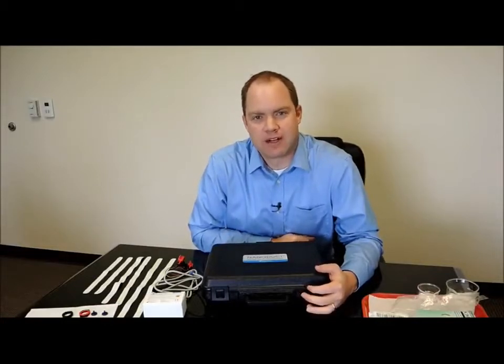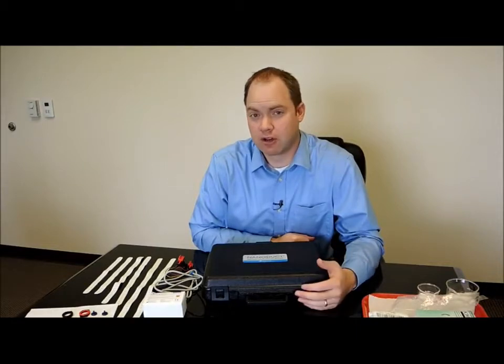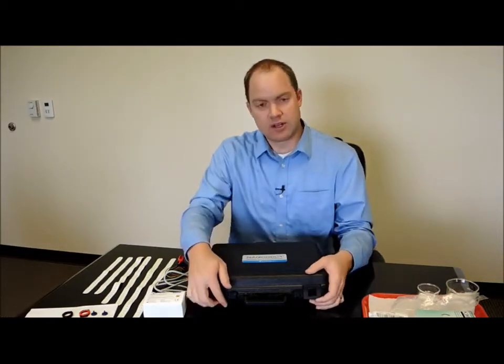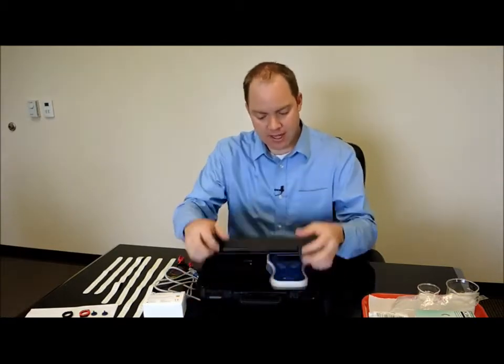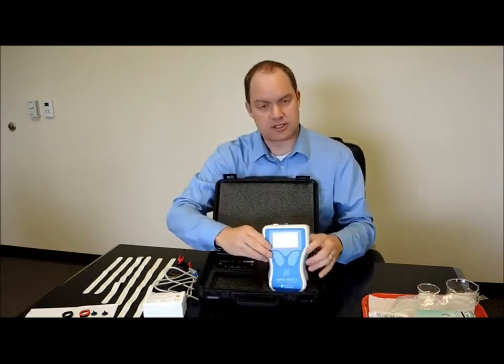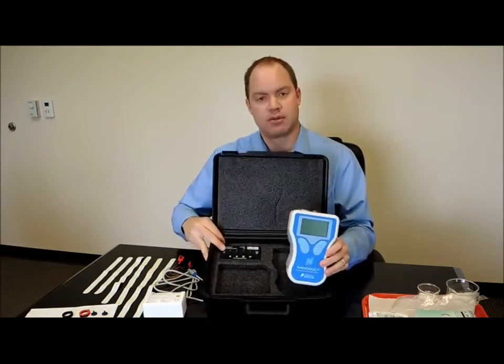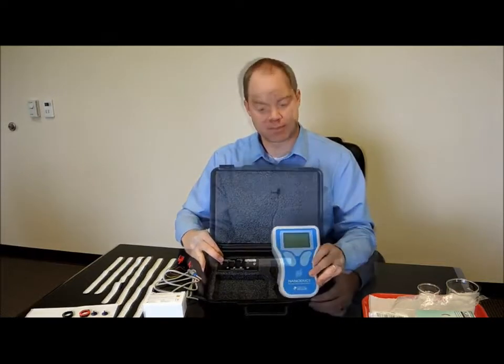I'm the program manager here at Elitech Group Biomedical Systems, and today we're going to show you a video about using the Nanoduct system. But before we use it, I want to describe what the Nanoduct is. When new, the Nanoduct comes in a nice carrying case like this, and this is the Nanoduct instrument. Also part of the carrying case is this calibration plate right here, and we'll show you how to use that here in a little bit.